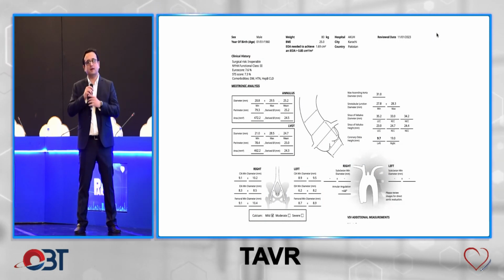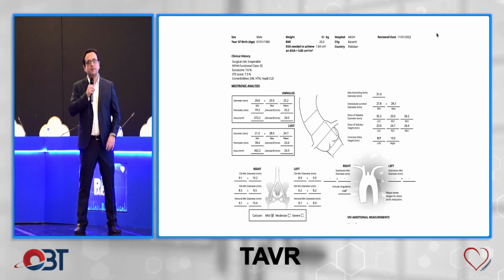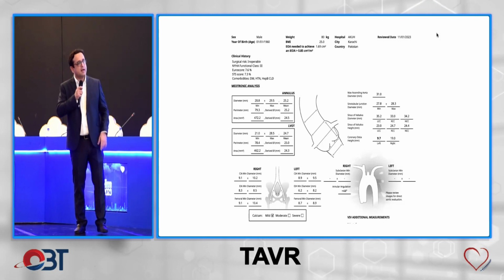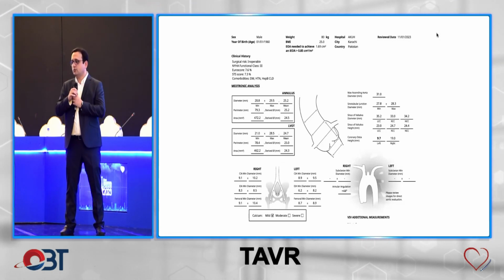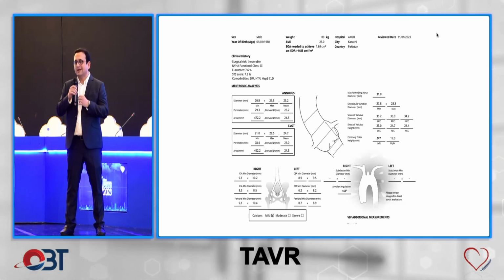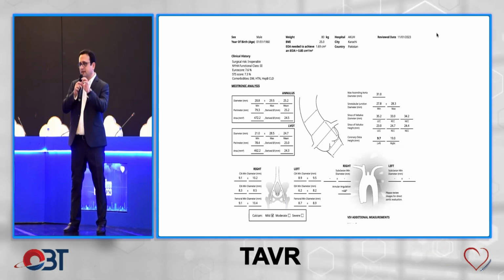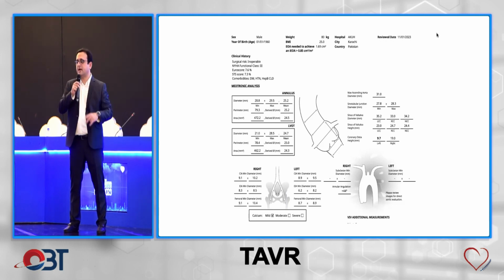तो again just to second your point कि CT के assessment is paramount and we have to do it. Question number 2 कि आप देखते क्या हैं? तो कल question was in the training village, the question was कि आप area देखते हैं, आप perimeter देखते हैं या minimum diameters देखते हैं. So what they have found is कि the biggest valve area that you get is by perimeter, and then you get area, and then after that is diameter based.